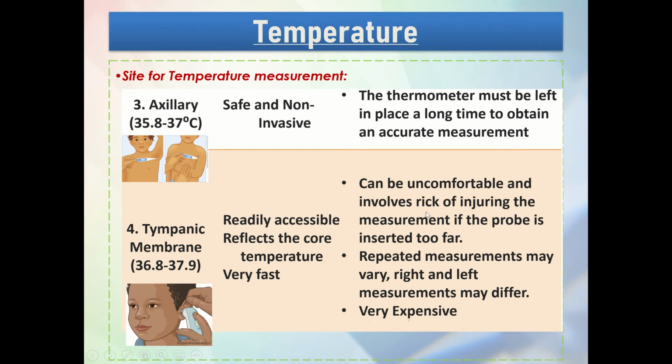Now, what are the disadvantages? It can be uncomfortable and involves risk of injuring the membrane if the probe is inserted too far. Kaya dapat we have to be careful in using this route for taking the patient's temperature. Repeated measurements may vary, right and left measurements may differ.